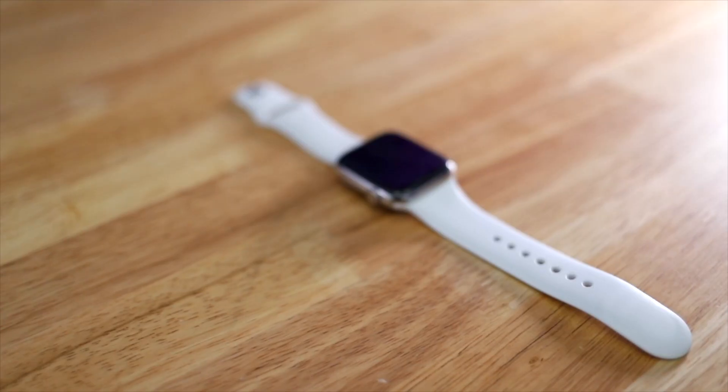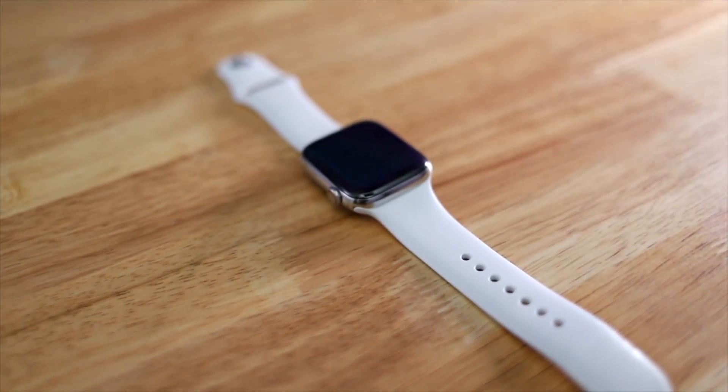After a few months of waiting, Apple has finally enabled the ECG feature on the Apple Watch Series 4, which is something I've been really looking forward to and super excited about since I got the watch when it came out. I wanted to give you a quick overview of what the ECG functionality is, how it works, and how well it works, at least in my experience with it so far.